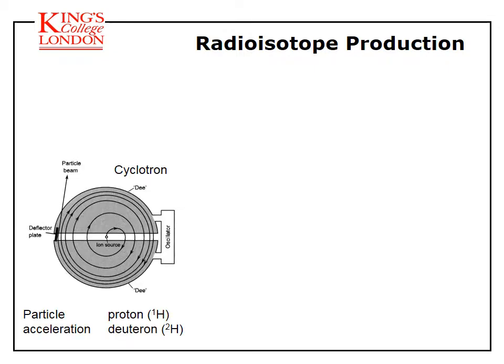Now, PET centers generally have a cyclotron, a particle accelerator. The particle can be an ion or a charged particle such as a proton that is injected into the cyclotron in its central space. The two halves of the cyclotron have opposite charge, and the charge is alternated so that the particle is accelerated and starts rotating until it reaches the expected energy.